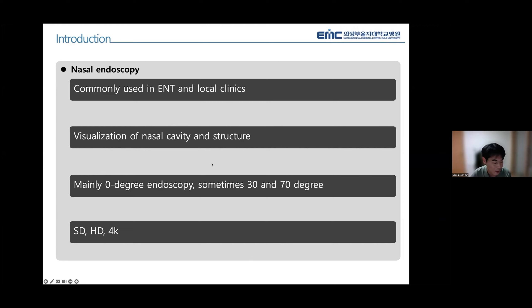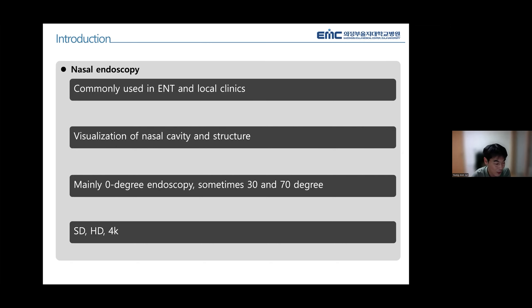Nasal endoscopy is a comprehensive diagnostic tool in otolaryngology and local clinics. It is used to examine and visualize the inside of the nasal cavity, and rhinology has been dramatically improved with the introduction of nasal endoscopes. These can be used at zero degrees and sometimes 30 or 70 degrees as needed.